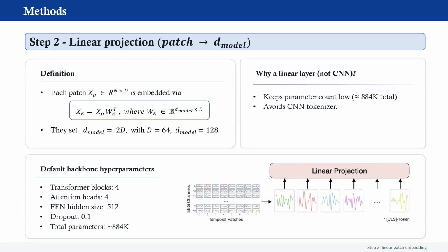It wouldn't really make a difference, but for someone who works with EEG data, it makes more sense to me to put the first channel first, then the second channel. Because you can look across channels, obviously, and that is exactly what EEGNet does.